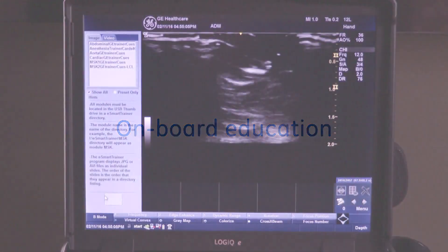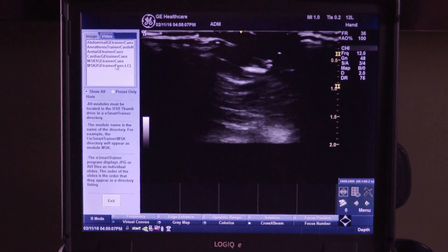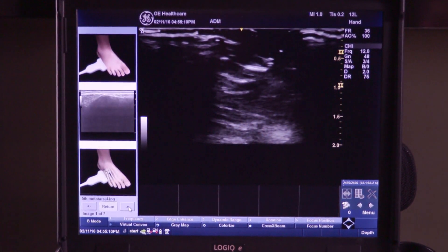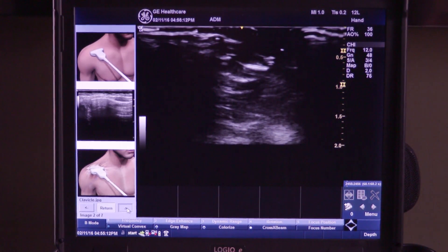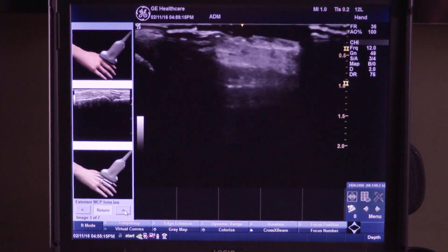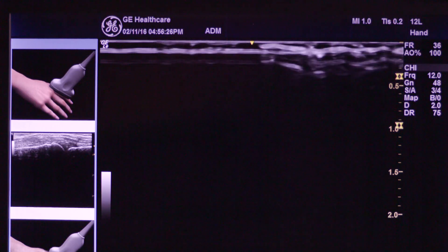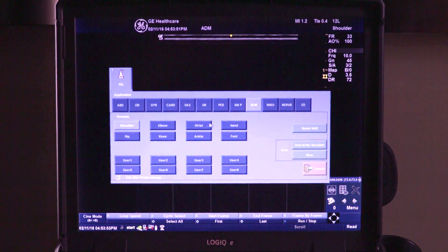In addition, we offer an onboard education option for purchasers of Logic E and Venue 50 systems. The eSmart trainer allows users to visualize an anatomical image for probe placement and ultrasound reference, either prior to a scan or while obtaining a live image during a procedure.